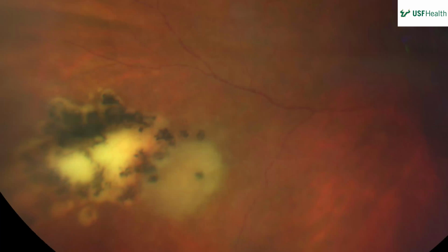So I see a much more distinct photo of this whitened lesion with spots of surrounding hyperpigmentation, some throughout the lesion as well as along the borders of it. You can maybe see a little bit of choroidal vessels below it or some sort of vessels within it. I don't know much more. Go ahead a little more.